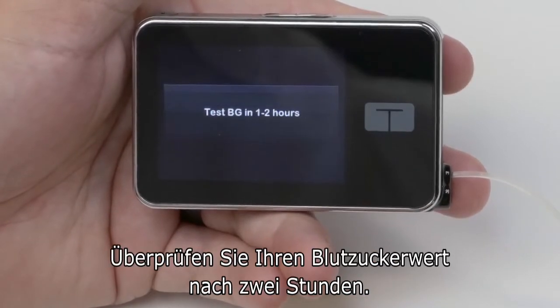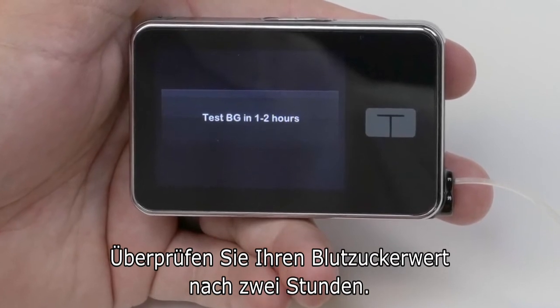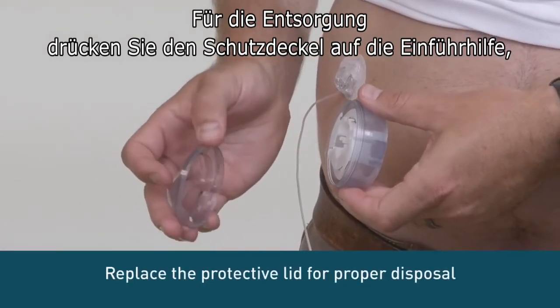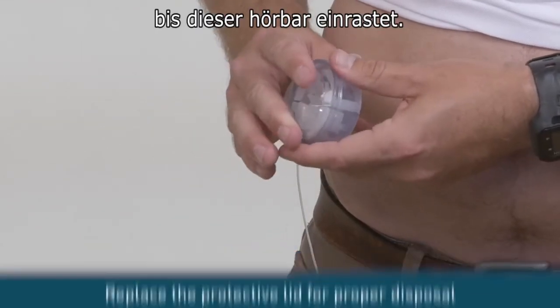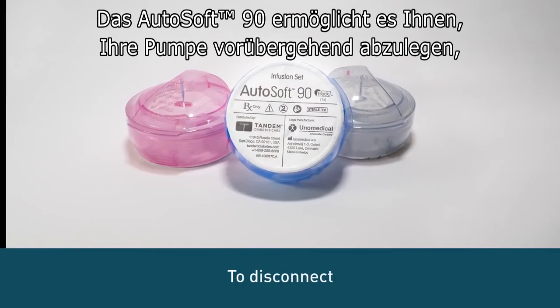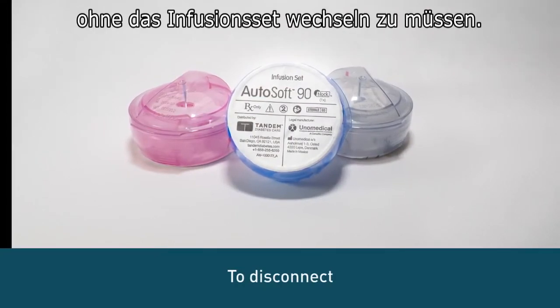Always check your blood sugar two hours after inserting to make sure it's working properly. Replace the protective lid on the inserter for proper disposal by pushing it until you hear it click. The AutoSoft 90 allows you to temporarily disconnect your pump without having to change the infusion set.